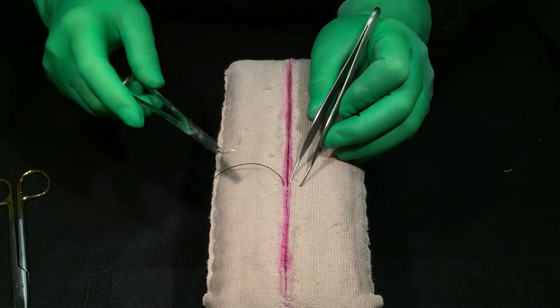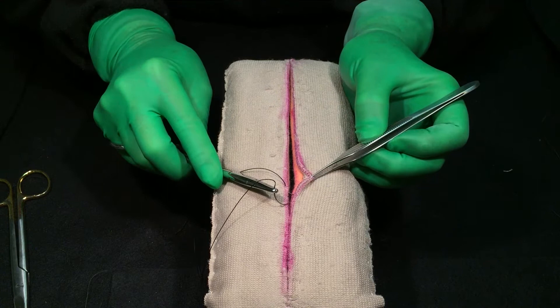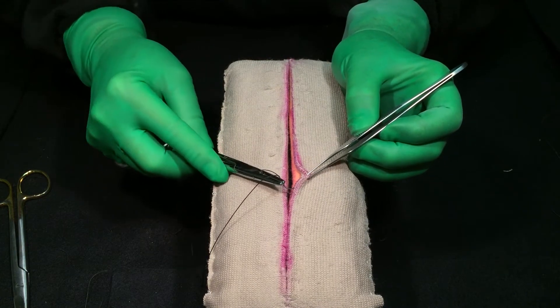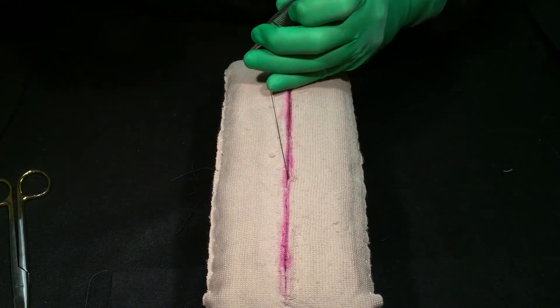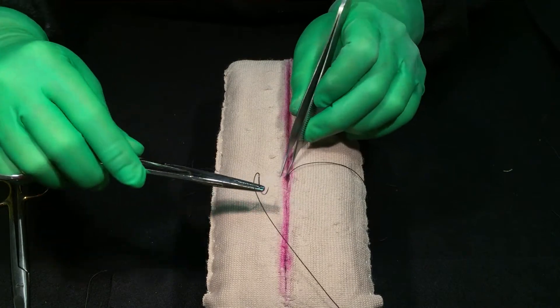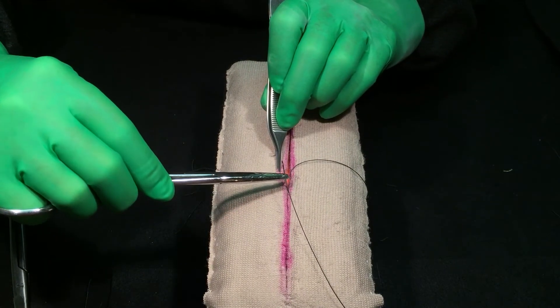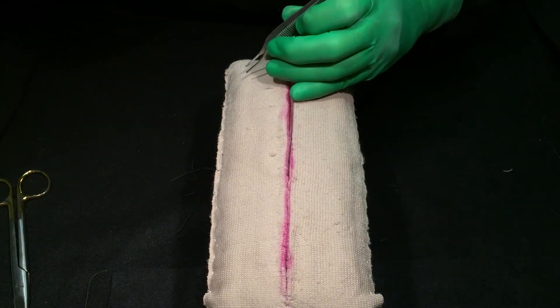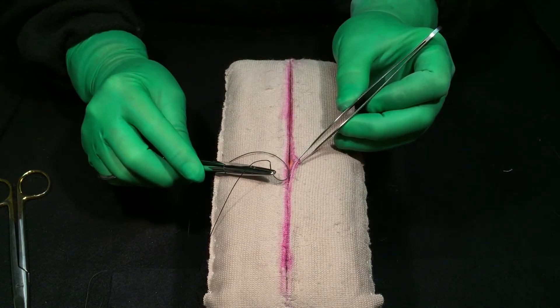Now the Z stitch — I've gone in here with my subcuticular. My last stitch is here. You don't want to go behind the last stitch or you lock it, but I go just in front of it, and then it's a tighter closure. There's my last stitch. I go just beyond it — that's the Z stitch — and you get a tighter closure because your suture is going back farther.